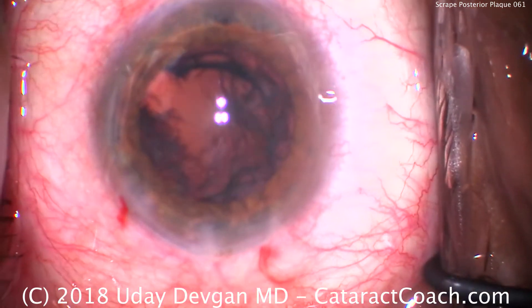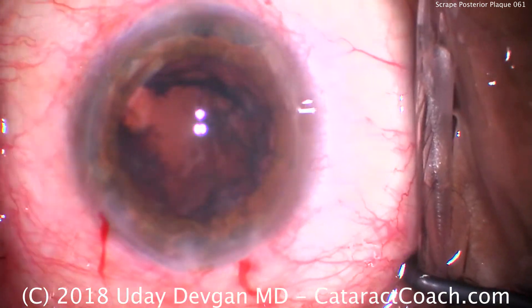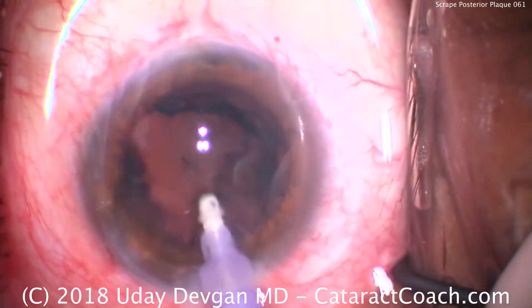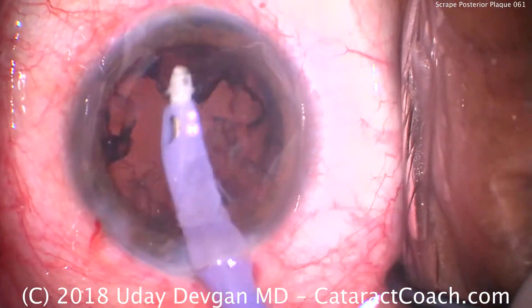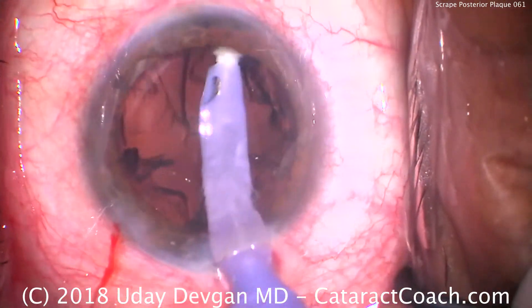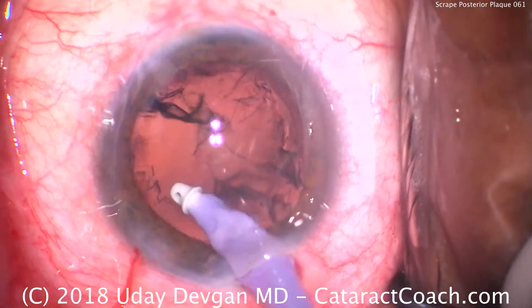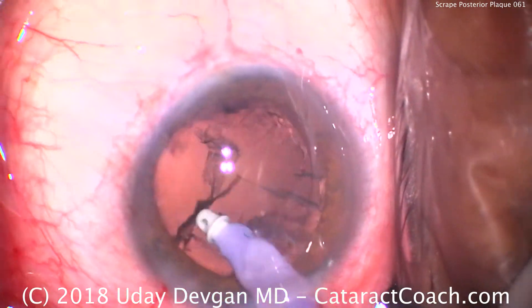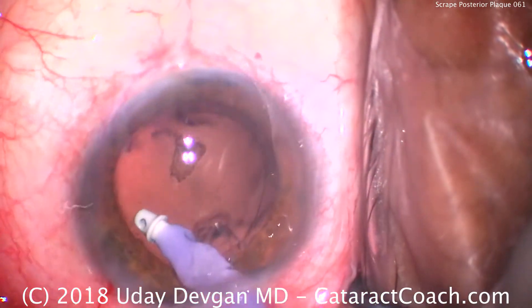We'll switch over to the IA probe to remove the cortex, and here's where we're going to see that posterior plaque. Settings for IA: about 40 cc's a minute of flow, 500 or more mmHg of vacuum, and a good high infusion rate. We use the probe circumferentially to remove the lens cortex — and at the end, there it is, the central posterior plaque.